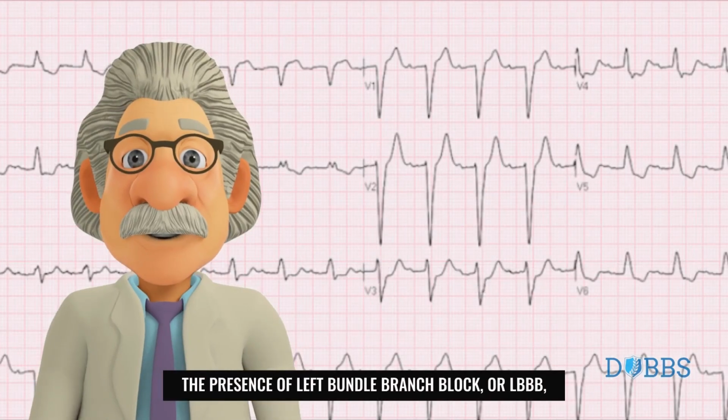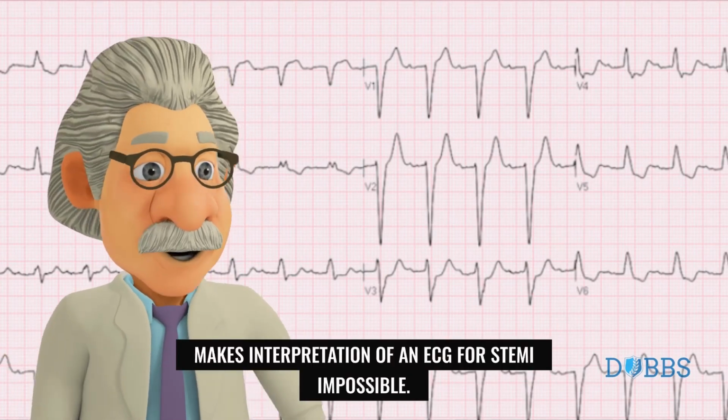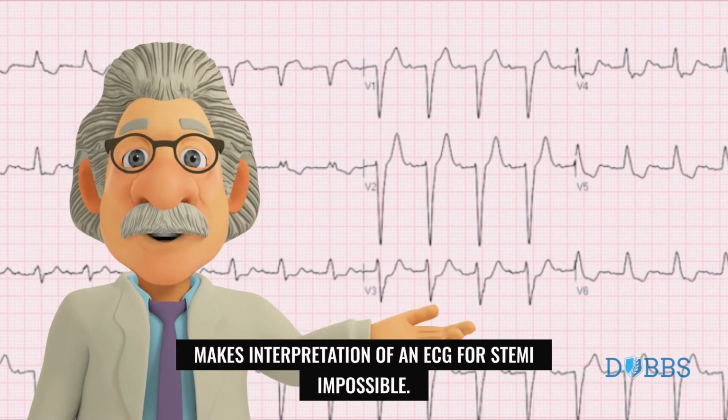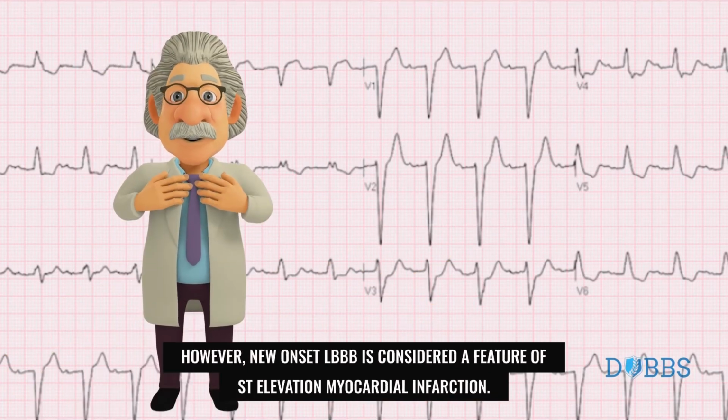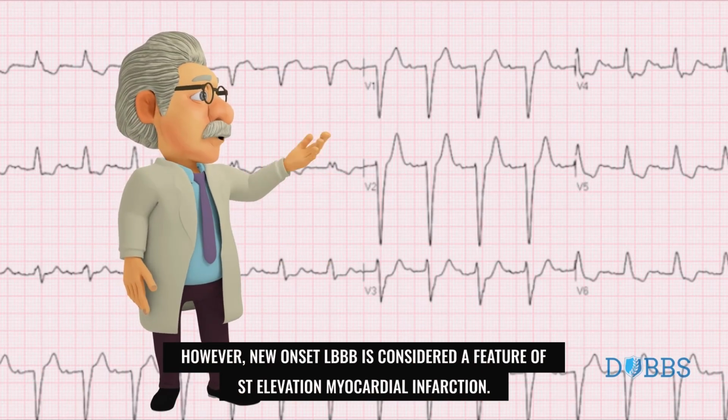The presence of left bundle branch block, or LBBB, makes interpretation of an ECG for STEMI impossible. However, new-onset LBBB is considered a feature of ST elevation myocardial infarction.